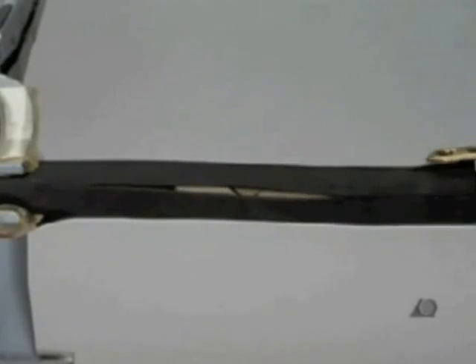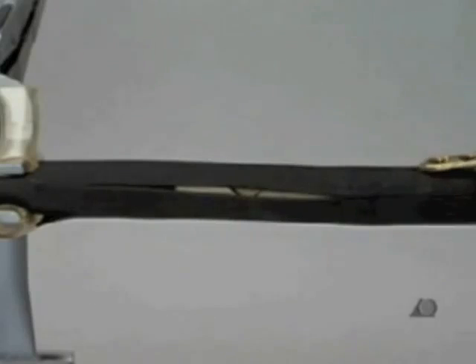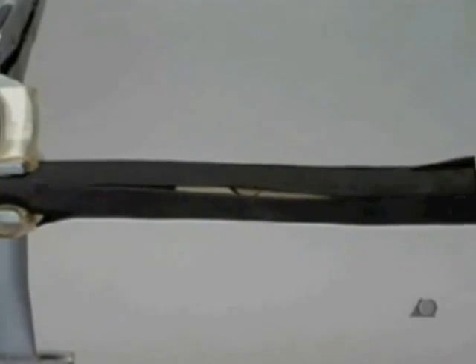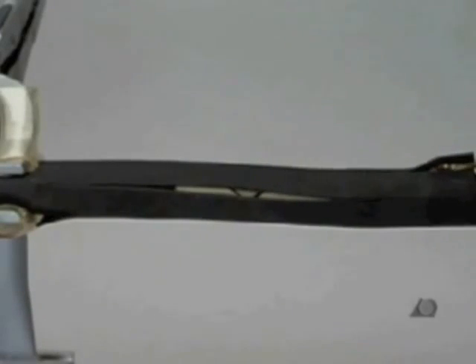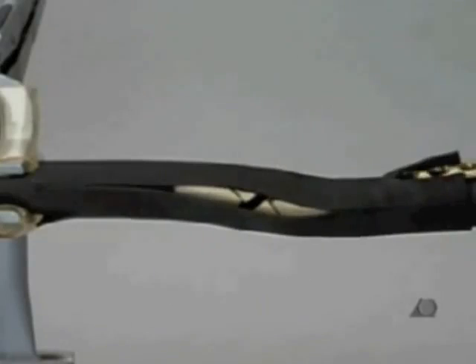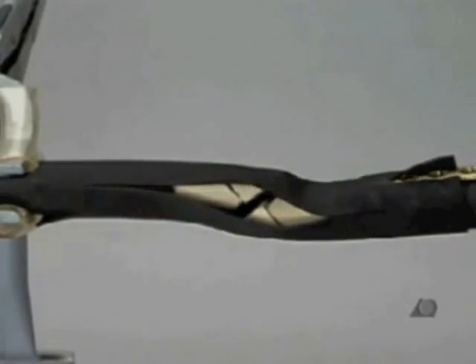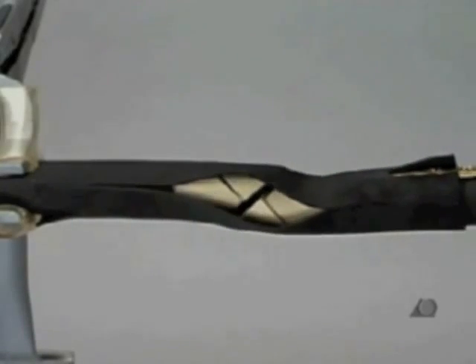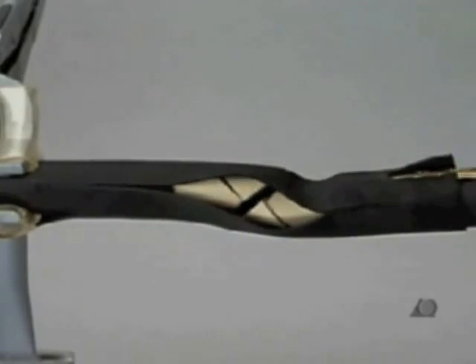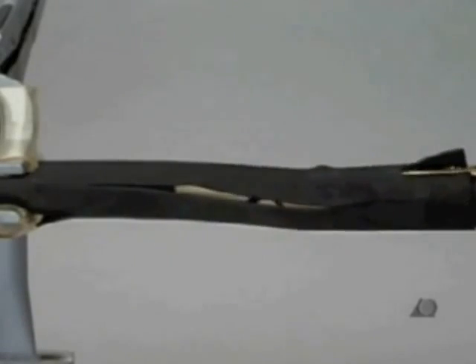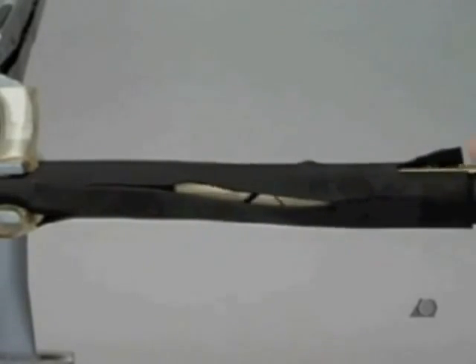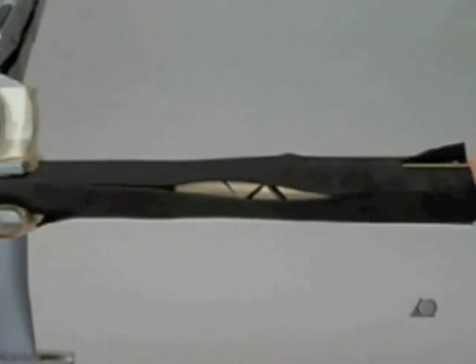The plate is gently introduced and slid under the soft tissue cover in the epiperiosteal layer. During insertion, the position of the plate should be monitored with the image intensifier. Here, the advancement of the plate can be checked visually.